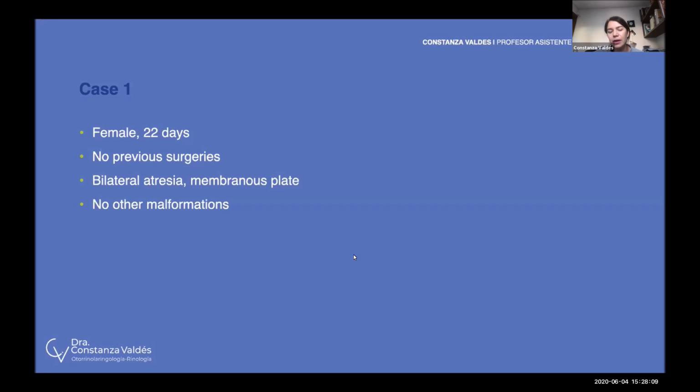Okay, great. And how about the infiltration of the mucosa? Do you usually use the same quantity, the percentages of adrenaline and lidocaine or naropin? What do you use for that? In the cases, I'm going to talk about this. Great. And do you put any Surgicel or fibrin glue or anything on the patients after the surgery? Yes, at the end, I usually use fibrin glue. And when I don't have it, I use Surgicel. Great. Thank you very much.